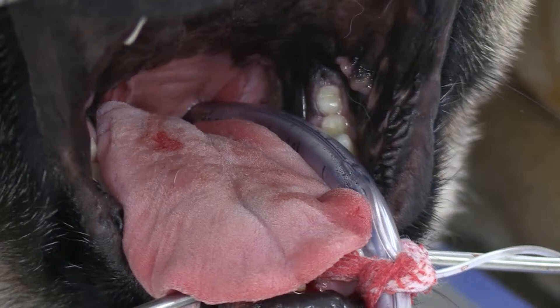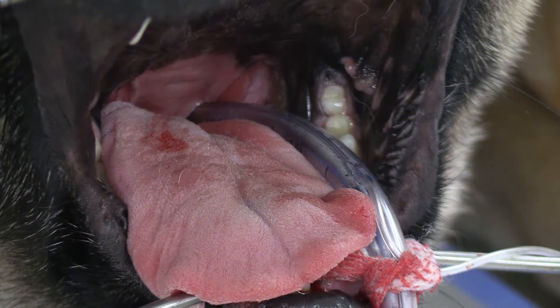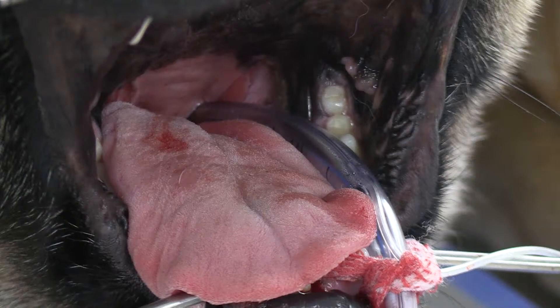Coblation is a really cool technology that creates a plasma field around the end of the probe and it basically vaporizes the tissue. This is yet another different type of electrocautery that we have.